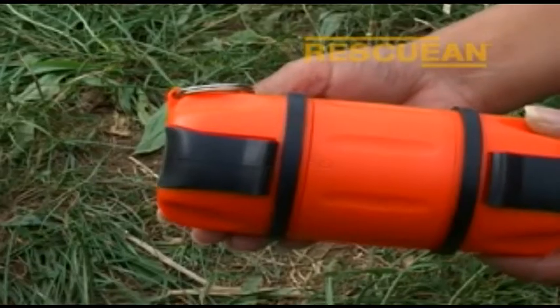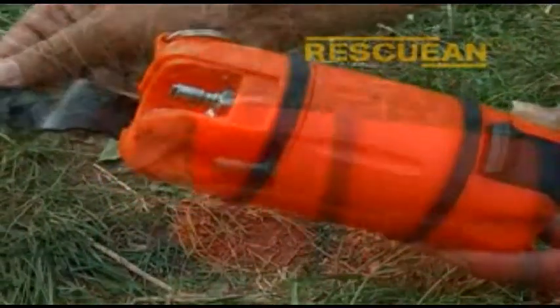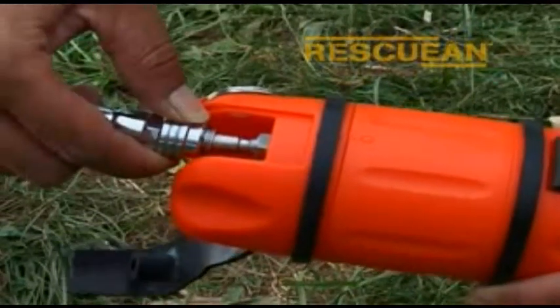The pod is simple, effective, and more importantly, quick to set up in an emergency. Simply flip open the rubber cover from the top of the pod and connect the low-pressure hose to the standard nipple.